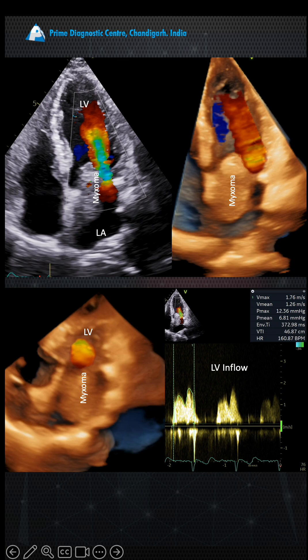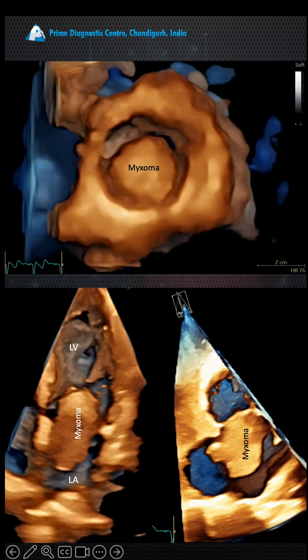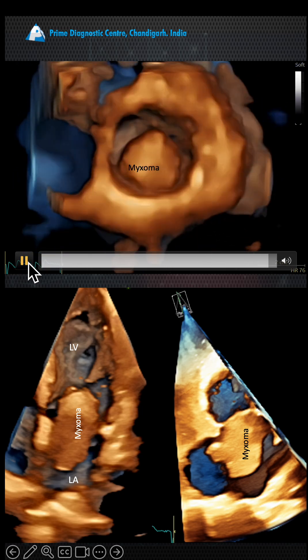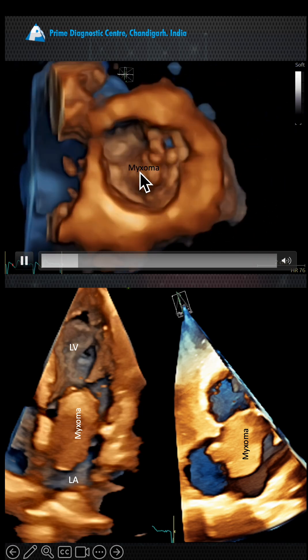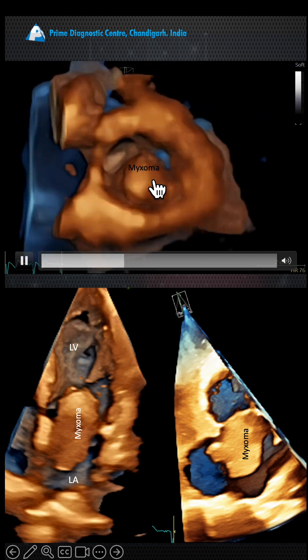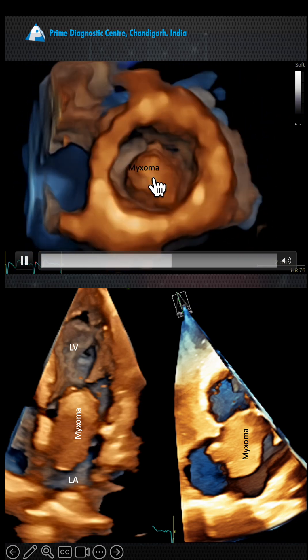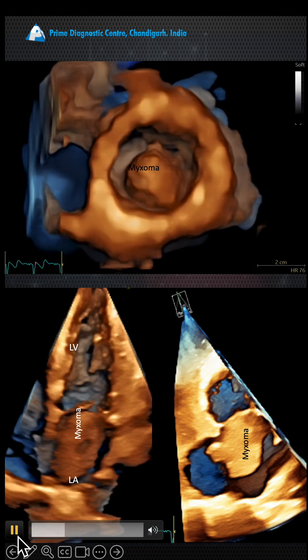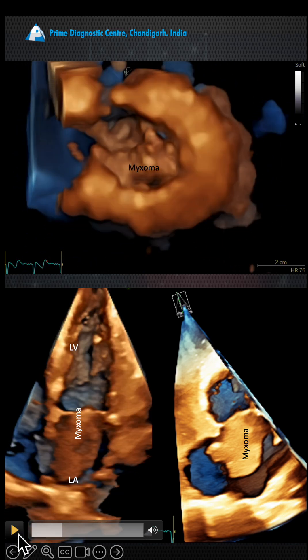This is the myxoma which is popping in and out. From the apical view, we can see the heart — that's the mitral valve — and during diastole you can see the myxoma heading up and down in the left ventricle. That is the myxoma clearly.